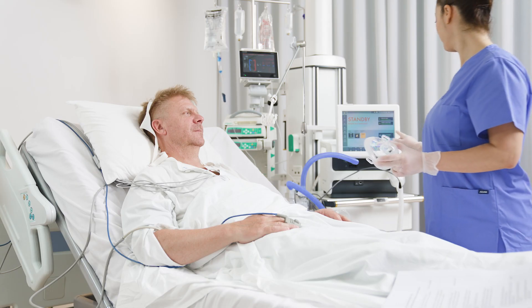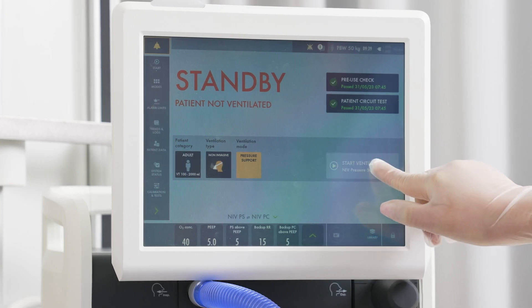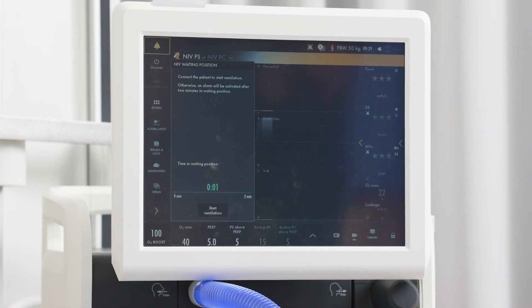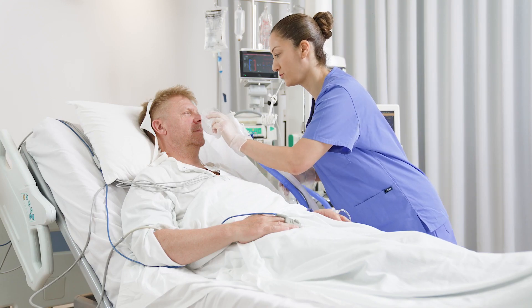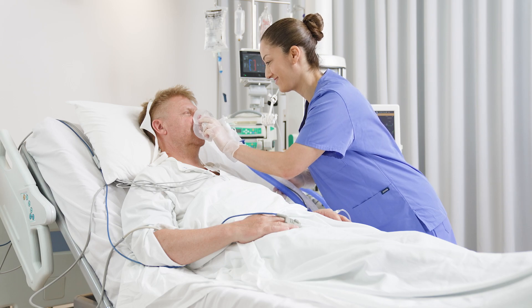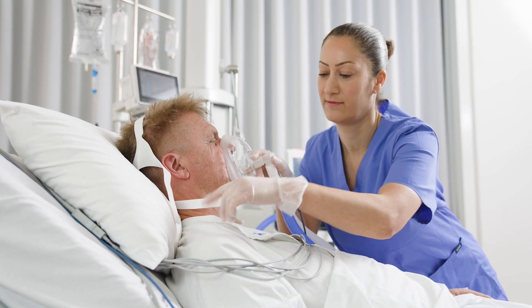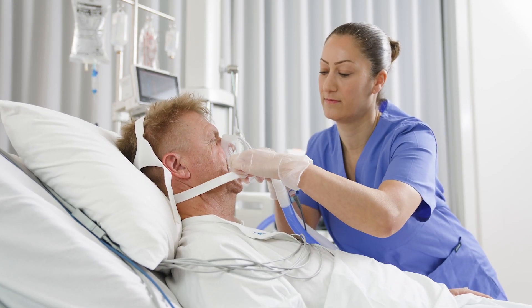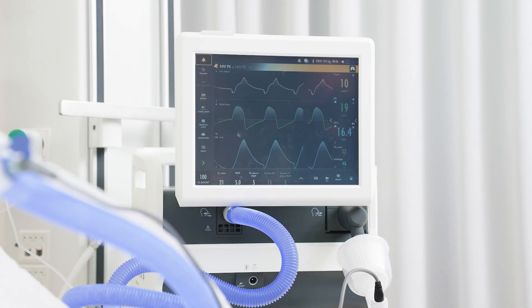An awaiting position dialog is seen on the screen. This will give you time to connect the mask to the patient without ventilation beginning. The ventilator will start automatically when it detects patient breathing.